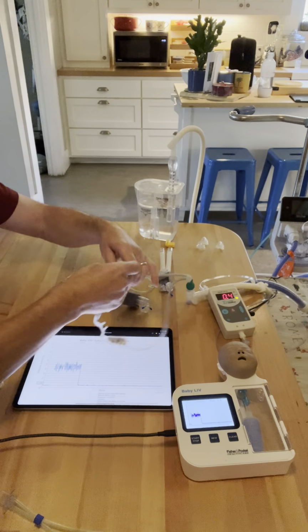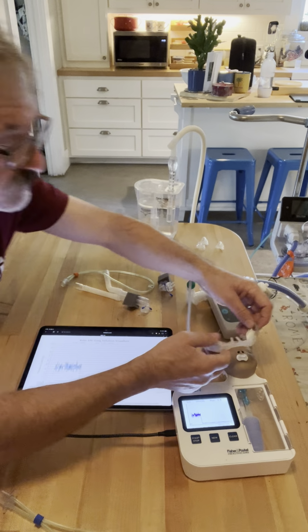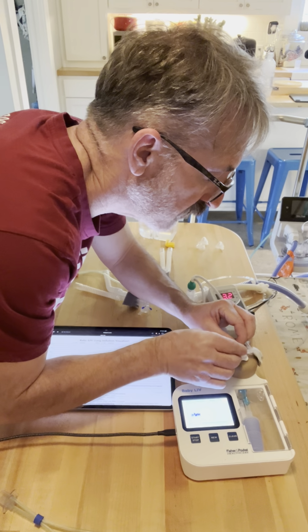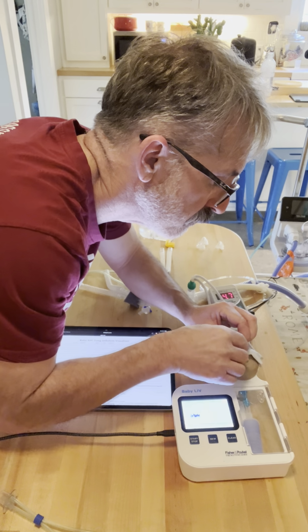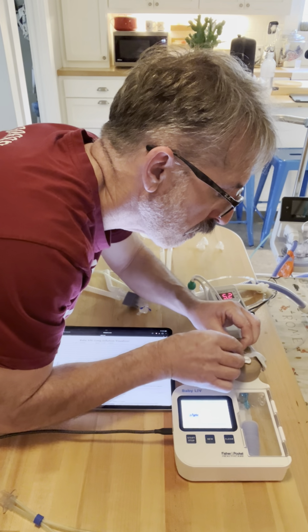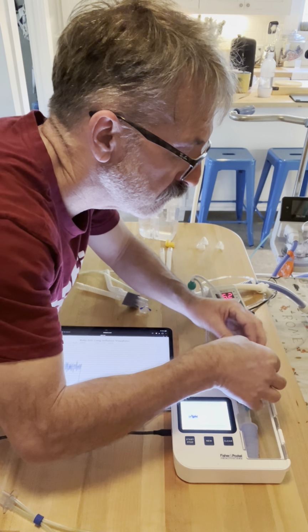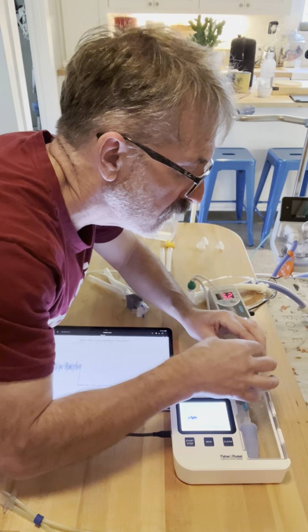Plug that in. Turn off, silence my thing. He also has monster prongs, so give me a second to get this into the baby's nose. Okay.